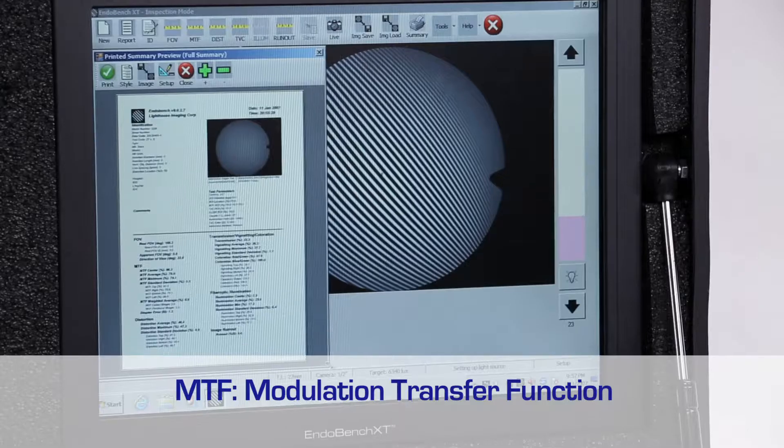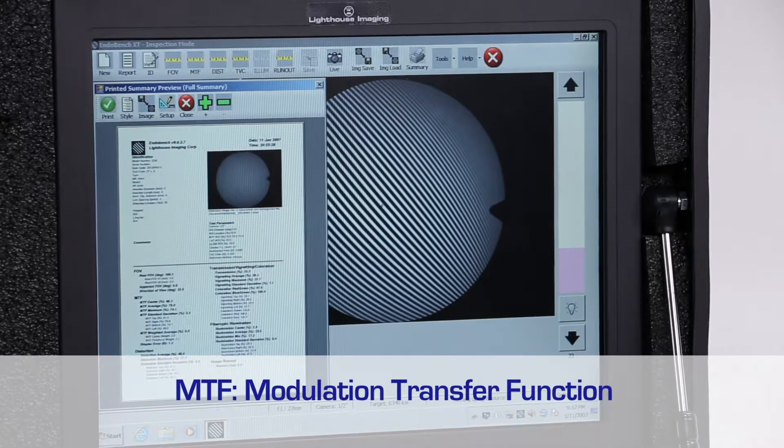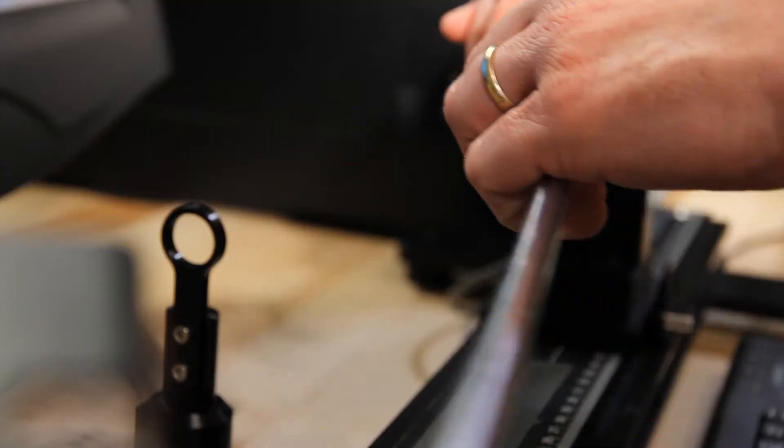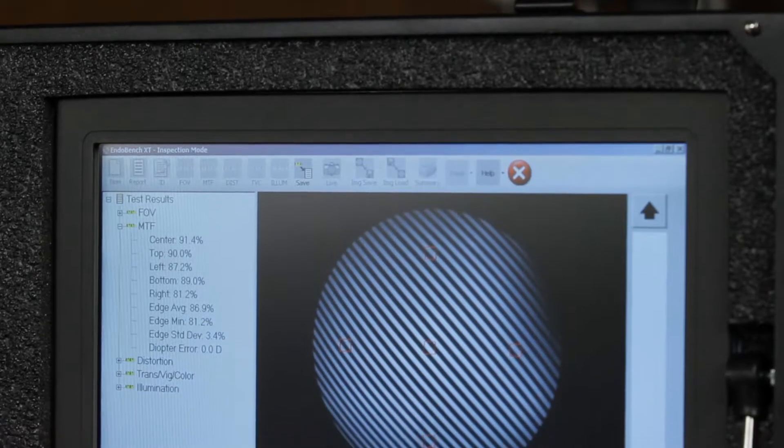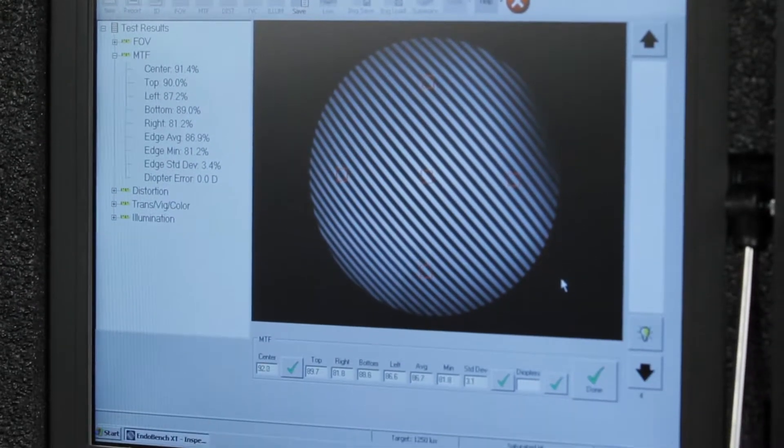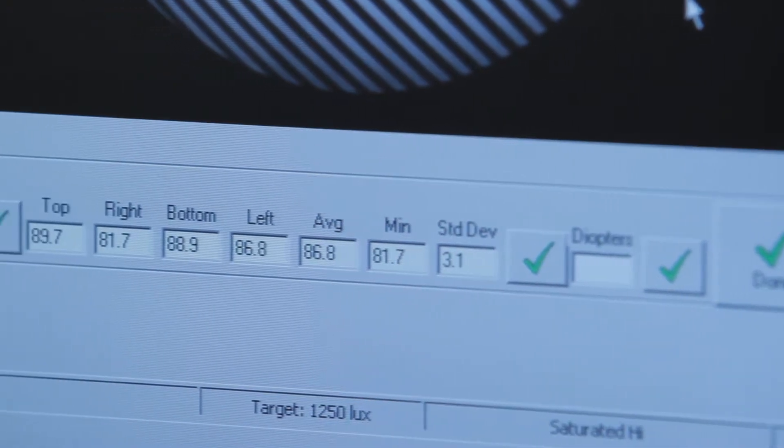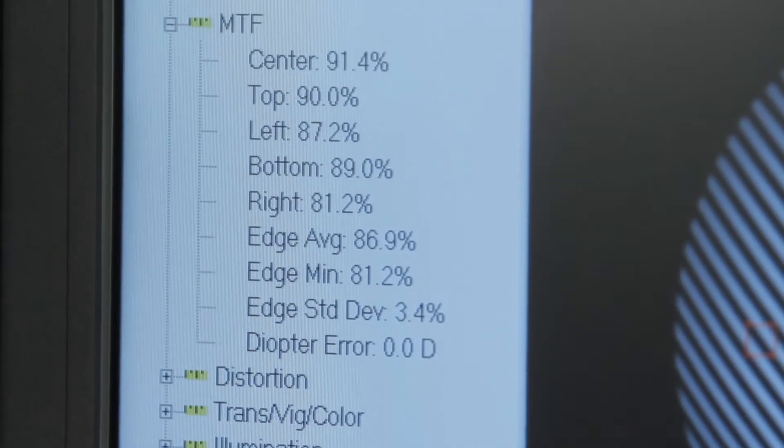MTF stands for modulation transfer function and it's really the heart of the EndoBench system. It's what allows you to quantify the image sharpness, which in the past has been the most subjective measurement and it's the most critical indicator of an endoscope quality. We provide a special black and white striped target and the machine vision system grabs the data from that image, compares the light and the dark regions, calculates the contrast, and comes up with the modulation transfer function.